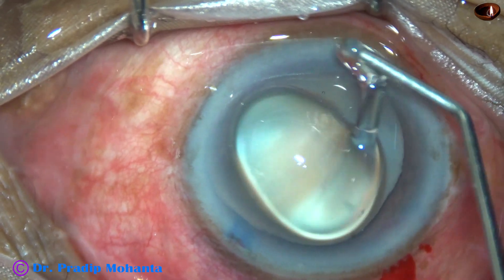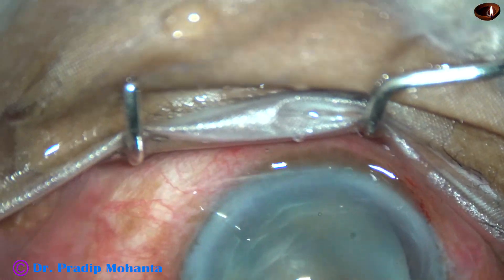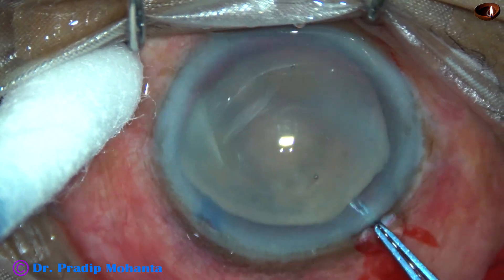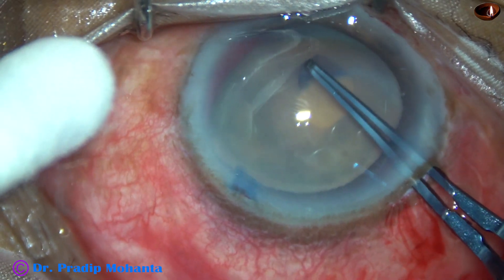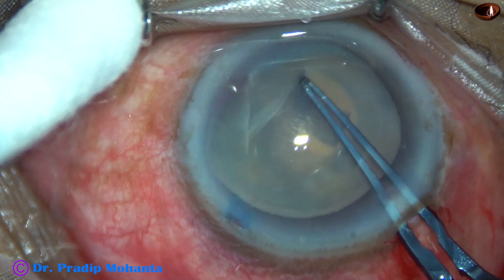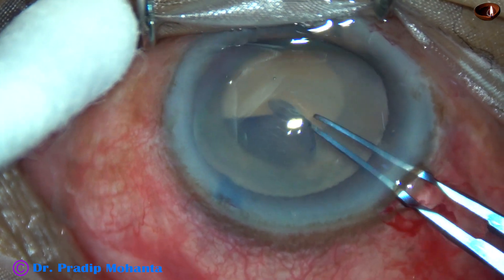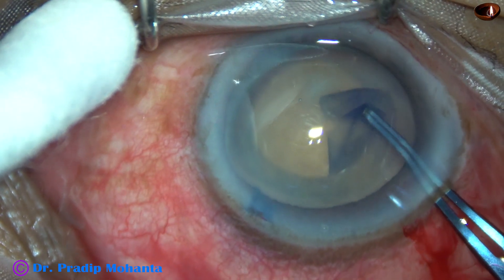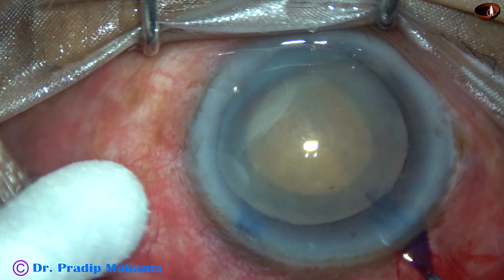After aspirating the milky fluid, visco is injected to fill up the anterior chamber. In this case, it has been applied over the corneal epithelium also. And now, with the help of utrata forceps, I am going to do a rhexis of about 5 mm, because I don't want to go to the periphery, as the zonular fibers may get entangled in the path of this rhexis. So this is a small rhexis of about 5 mm — it may be even 4.75 mm.